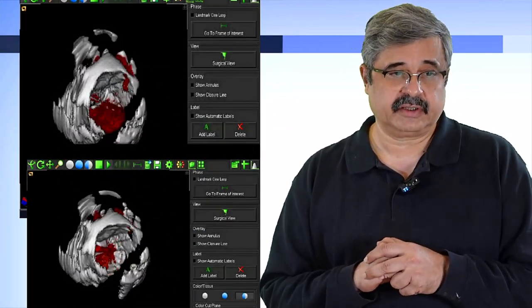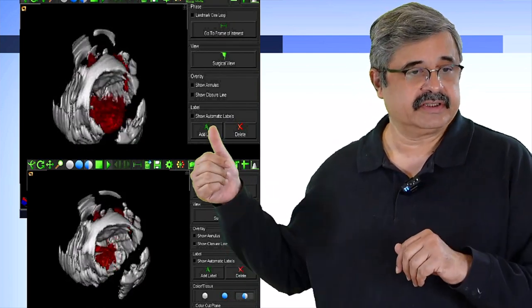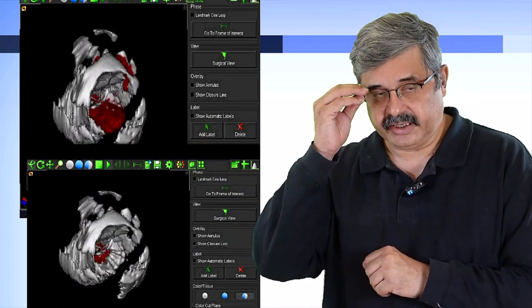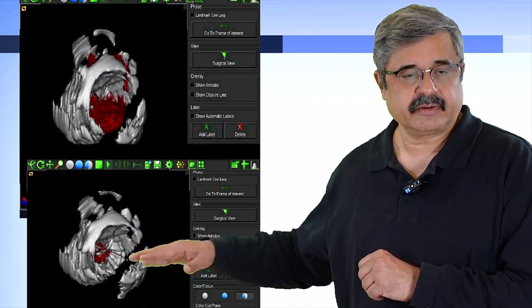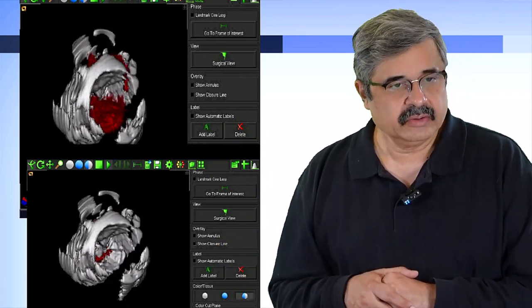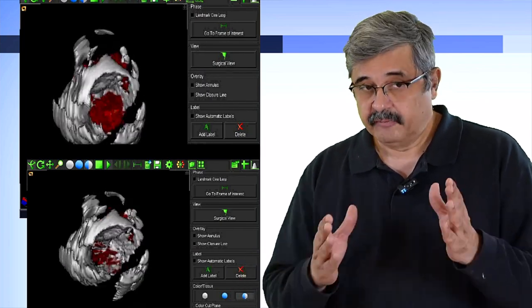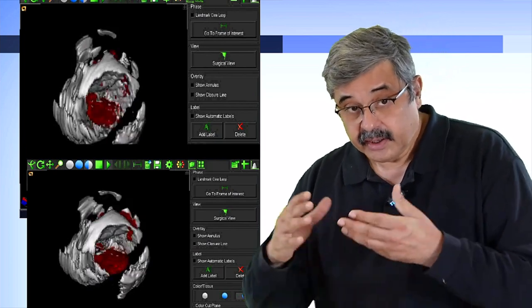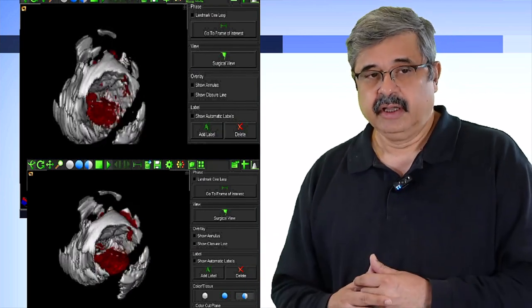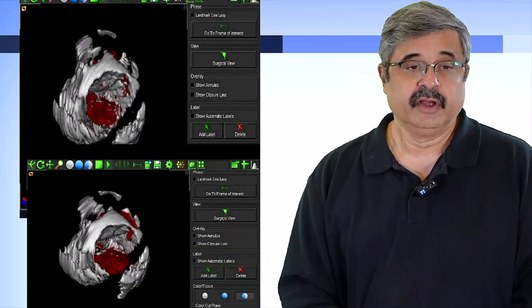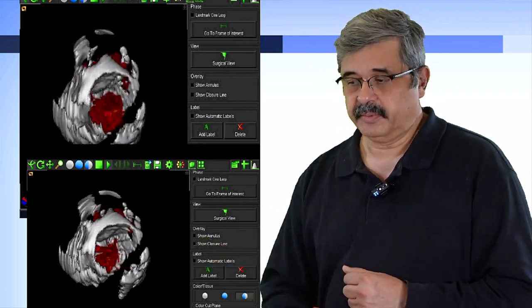One of the greatest strengths of this system was the ability to manipulate grayscale and color Doppler information separately. In this example, you can see a mitral regurgitation jet coming centrally. In the lower panel, we are maintaining the grayscale but cropping down the color Doppler information to the base of the mitral valve to demonstrate that the jet is coming from a particular location. For high-end interpretation of the site of mitral regurgitation and quantification — if the patient had normal sinus rhythm — you could achieve very high-quality reconstruction and interpretation.